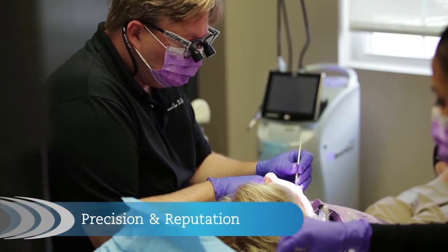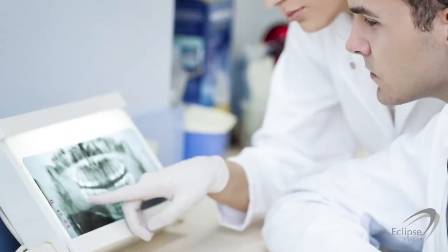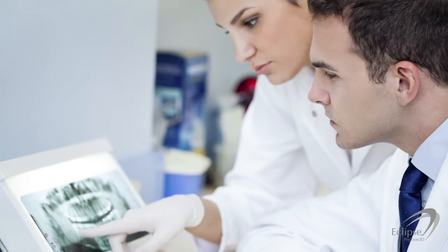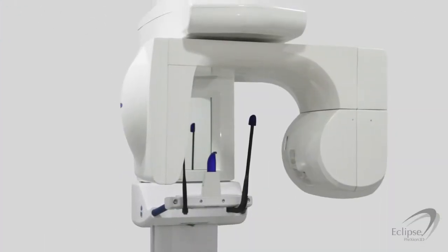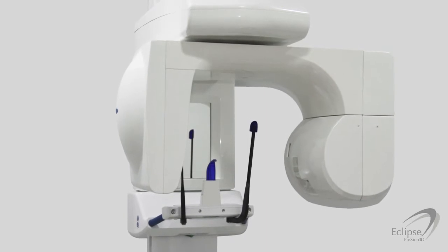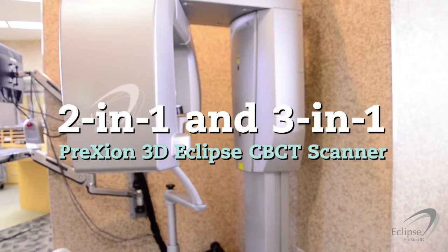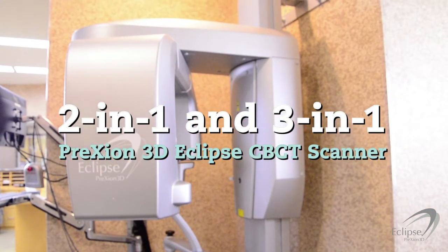In dentistry, precision can determine reputation. Imagine the stress that comes from misdiagnosing a patient or misplacing an implant because of inaccurate information. Rather than trusting your practice to lesser quality 2D or 3D scanners, see how the 2-in-1 and 3-in-1 Prexion 3D Eclipse CBCT scanner can provide flexibility, confidence and clarity.